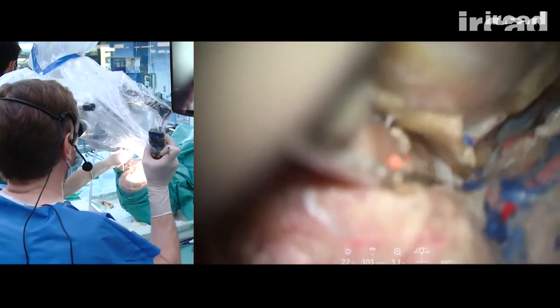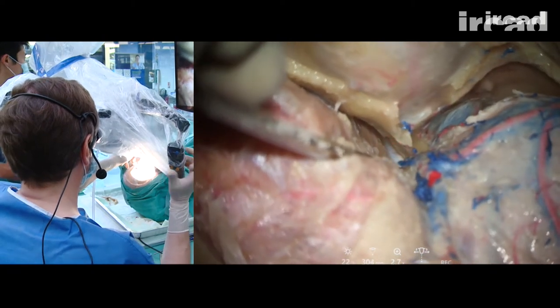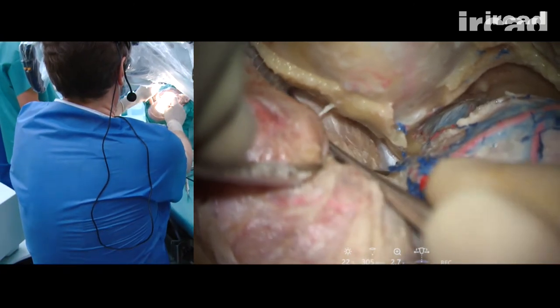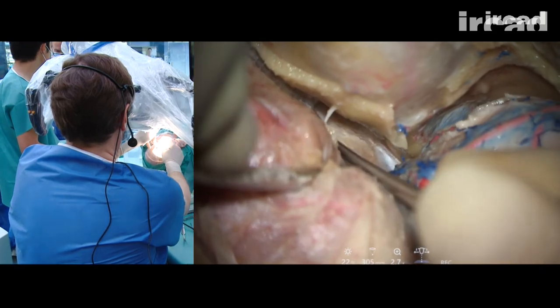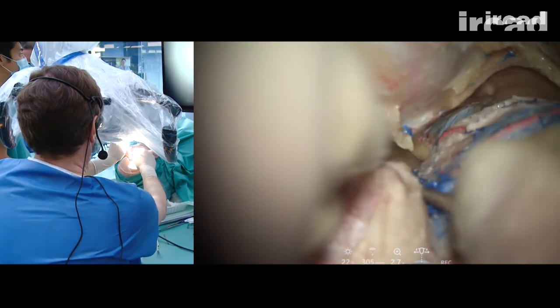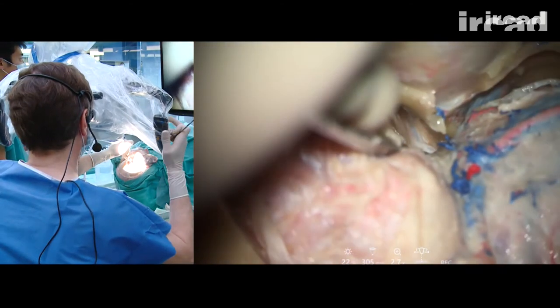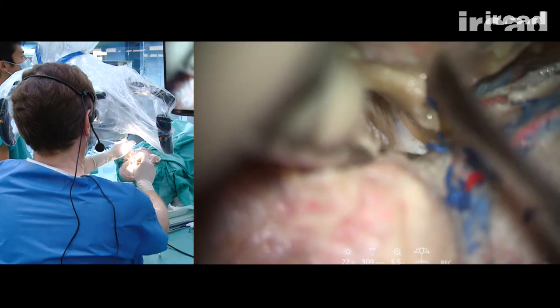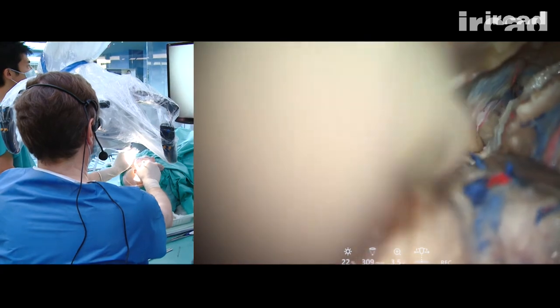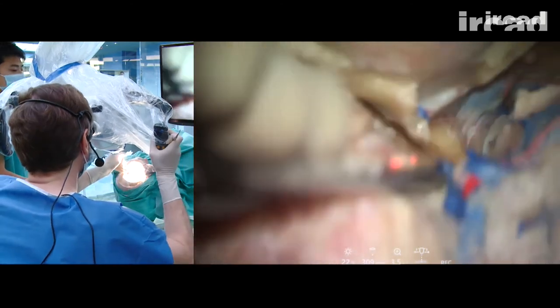The brain is a little bit stiff here, so it will not necessarily be easy to do the clinoidectomy in this situation. This is already the entry point of the optic nerve into the optic canal. I can see the falciform ligament here. So exposing the clinoid process like this makes it much safer, much easier.